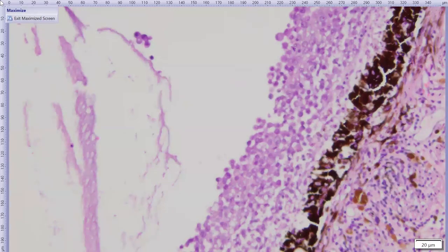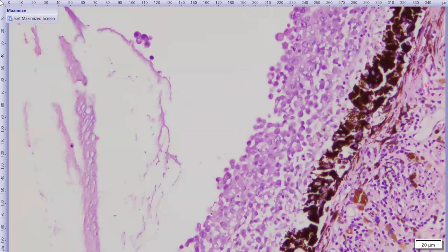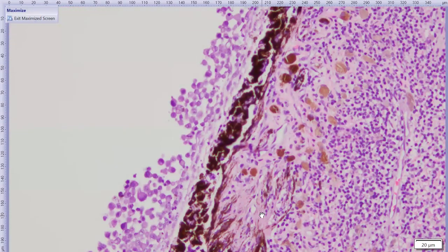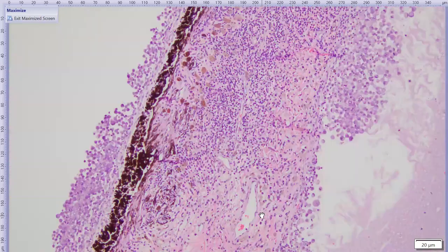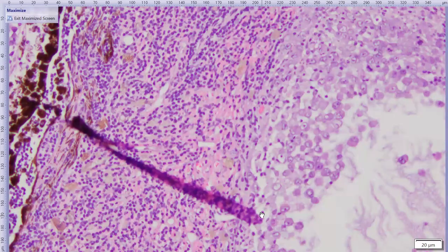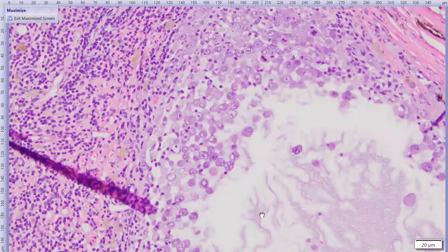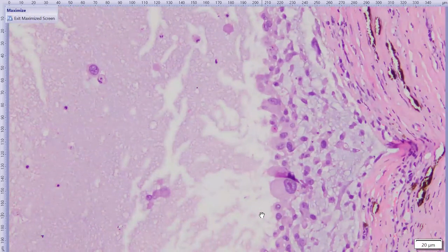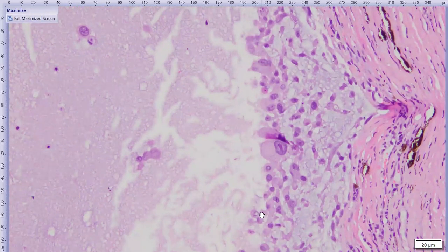And when we look closer at these guys, they turn out to be neoplastic cells. So up here, they look kind of round and distinctly demarcated. And let me take you up here really quick without being too high. Let's see if I can find my favorite cell of this case. Here we are. There we go. My favorite cell of this case.